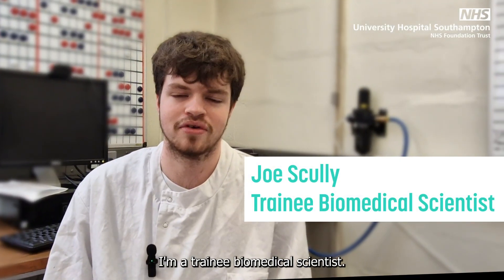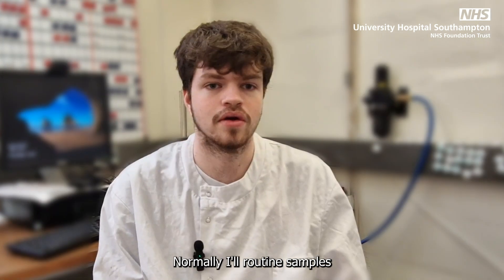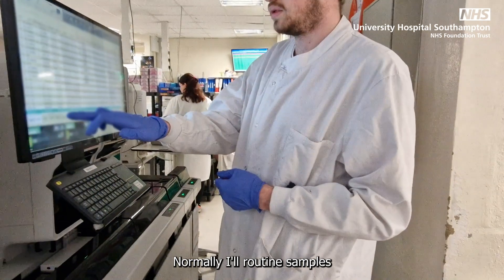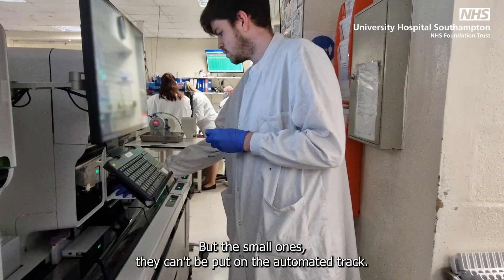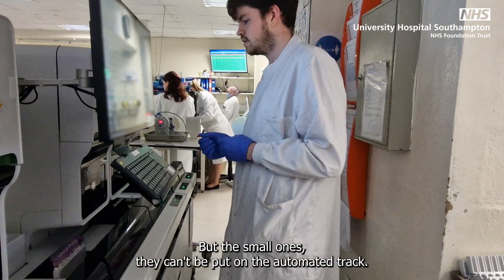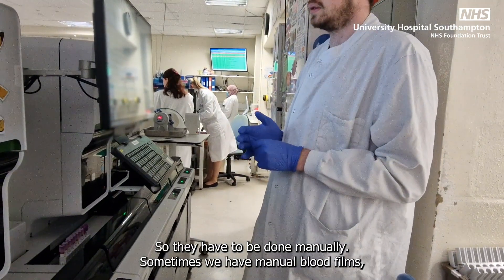My name is Joe Scully. I'm a trainee biomedical scientist. Normally our routine samples for haematology are loaded onto the front of the analyzer, but the small ones can't be put on the automated track, so they have to be done manually.